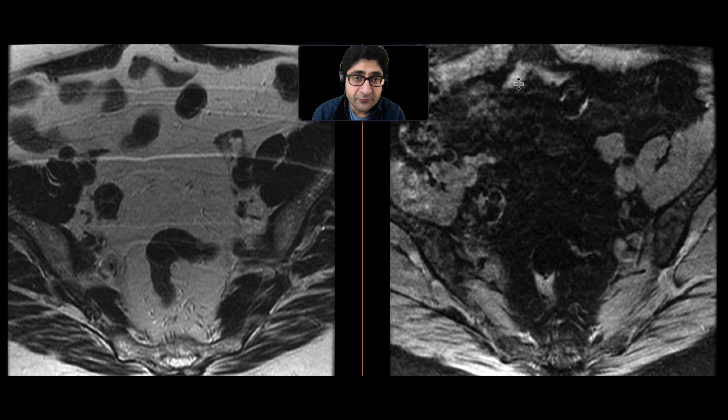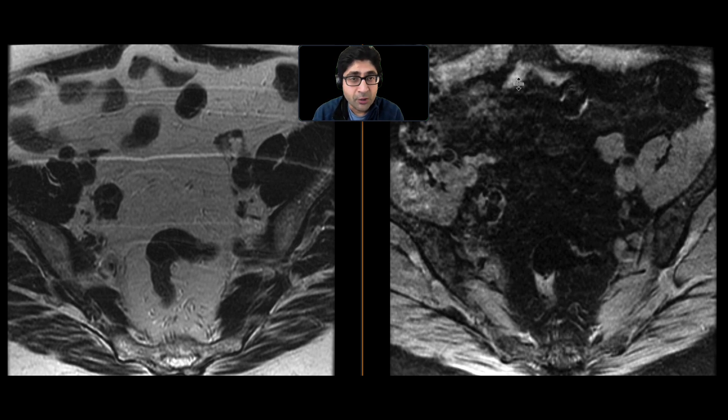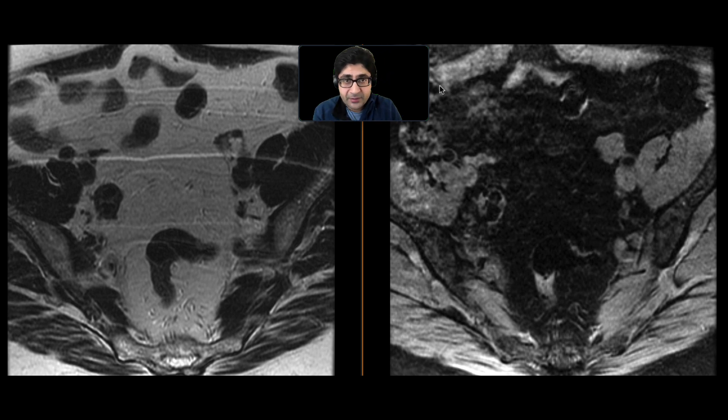This is a patient who presented with pelvic pain, got an ultrasound that was essentially unremarkable, and got an MRI to further evaluate the etiology of the pain.